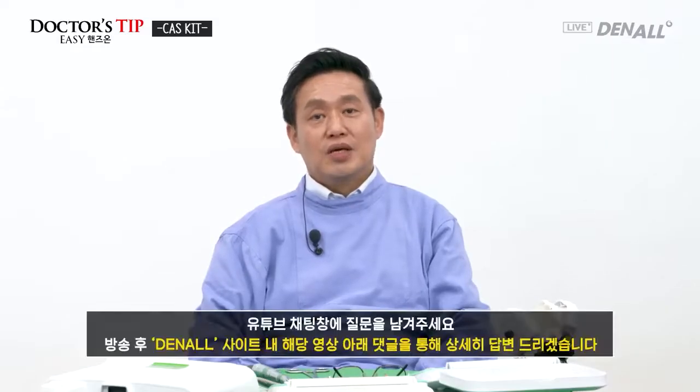Doctor's tip, easy hands-on. I've introduced the CAS KIT. I believe you already have used it a lot, and many doctors know about the CAS KIT, but through the hands-on, as I showed you, if you understand the CAS KIT properly, regardless of the residual bone height, in various cases, you will be able to do the bone augmentation on the sinus floor to place implants. I believe if you are skilled in using the CAS KIT, it will be very helpful in placing implants properly.